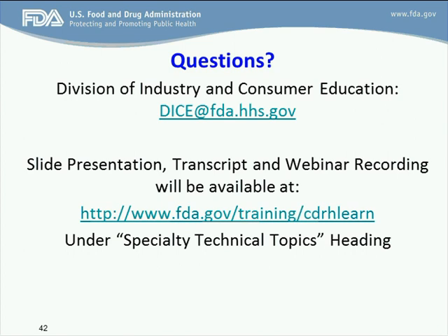My last question pertains to Criterion 2, which mentions the use of protective covers and states that cleaning instructions should assume the worst-case situation in which the device is used uncovered. I'm wondering whether the agency considers a scenario in which performance criteria for a device-specific protective cover could justify use of a critical device after disinfection rather than sterilization.